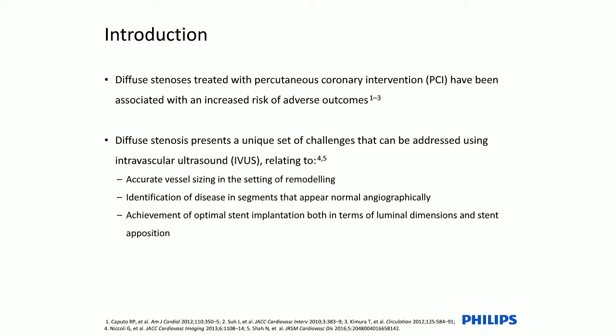Now, for the interventionist, diffuse stenosis or diffuse coronary artery disease presents a number of challenges that can be addressed by using intravascular ultrasound. First, we have to remember that during atherogenesis, we have a remodeling of the vessel, and that judging this from the angiogram is not possible.